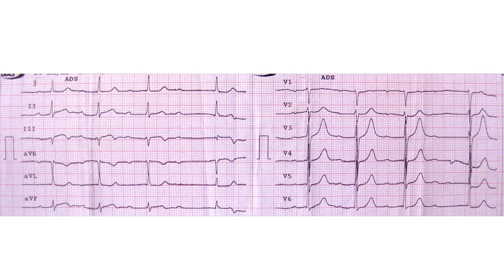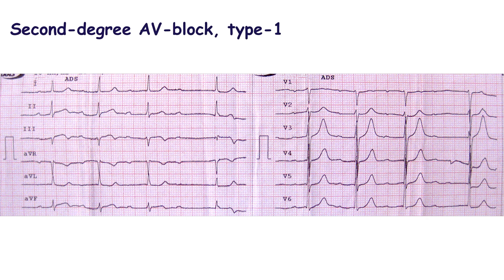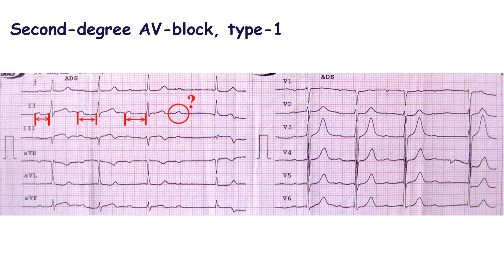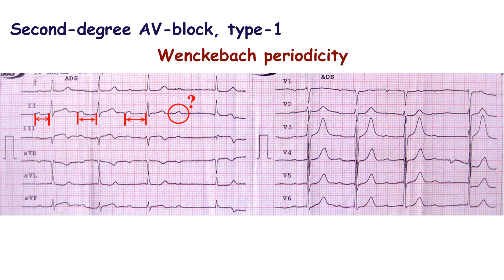It should be assumed that this is a second degree type I atrioventricular block, which is characterized by gradual prolongation of the PR interval up to the non-conducted P wave. The PR interval following the non-conducted P wave is the shortest, and then it gradually prolongs to the next non-conducted P wave. This is called Wenckebach periodicity.